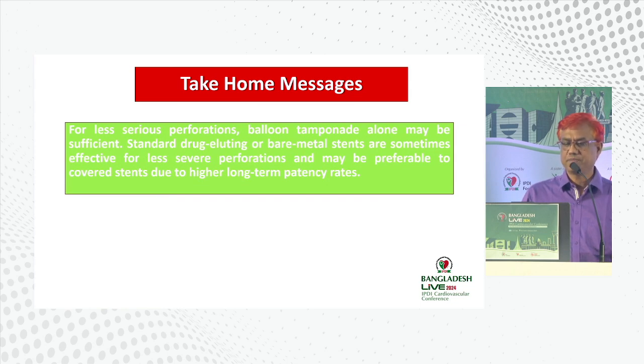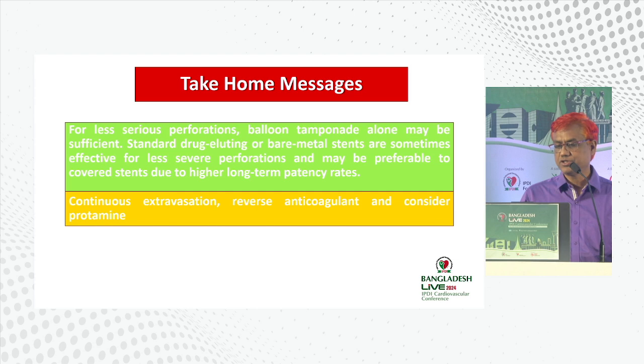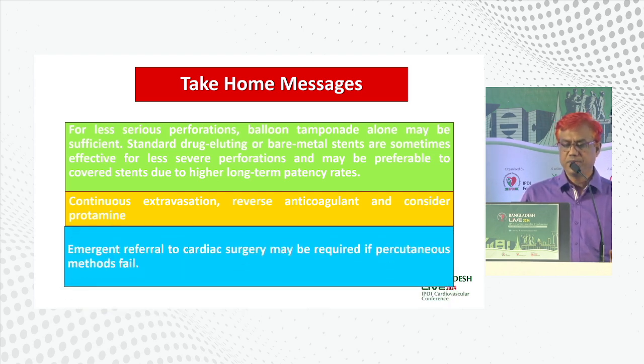For less serious perforation, balloon tamponade alone may be sufficient, but we may use a drug eluting stent or bare metal stent. For continued extravasation, reverse the anticoagulation and consider protamine. If not improved, call the surgeon.